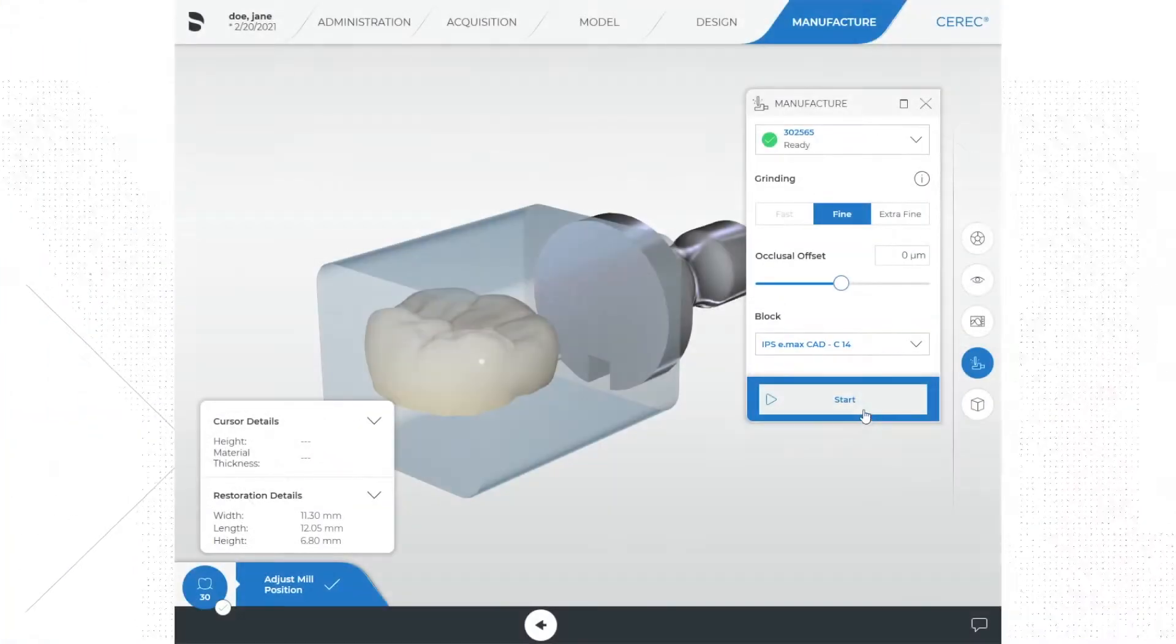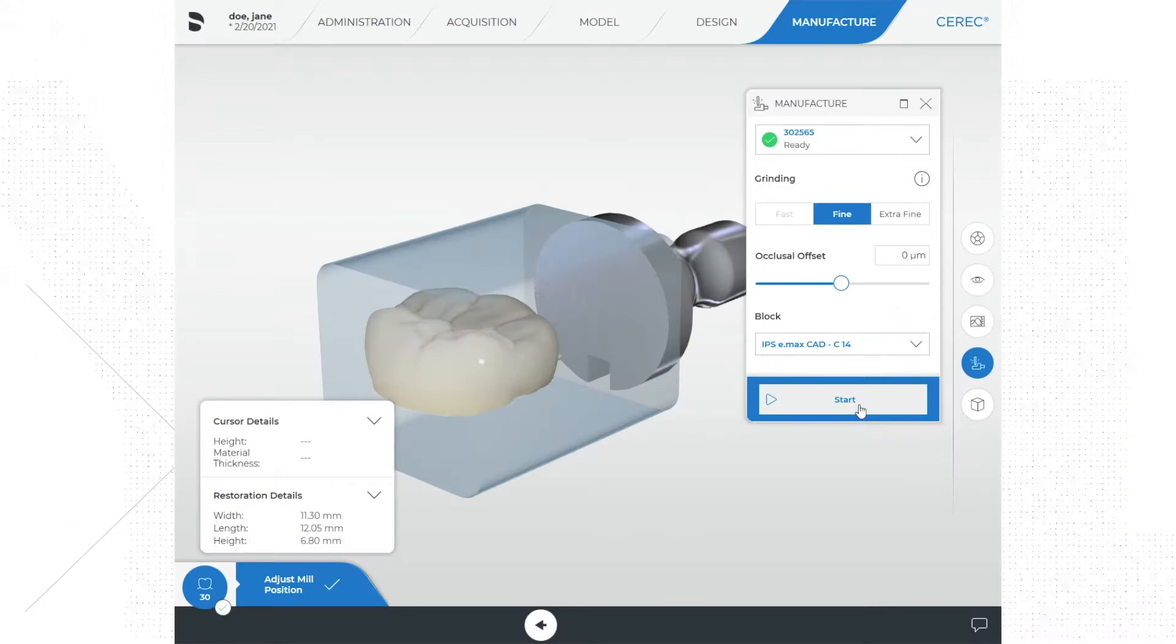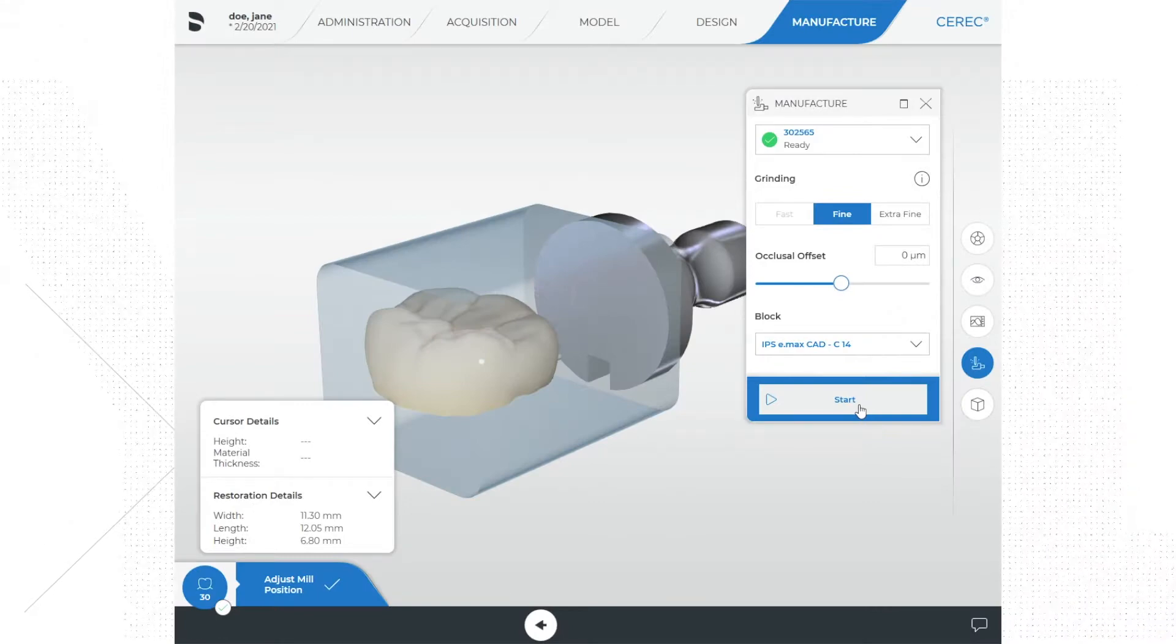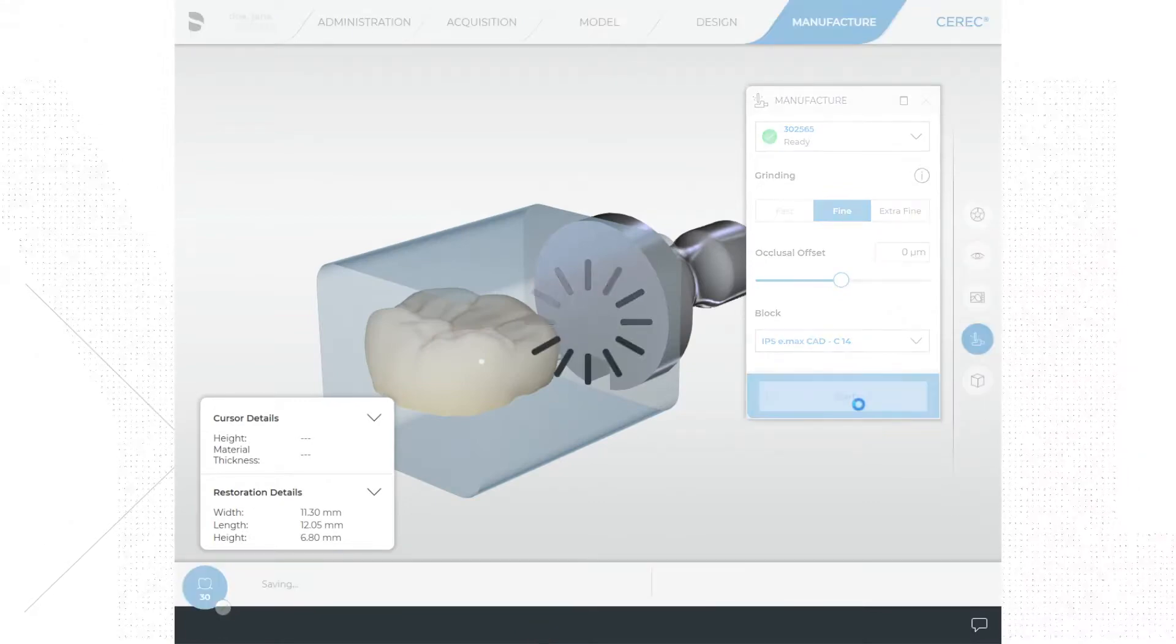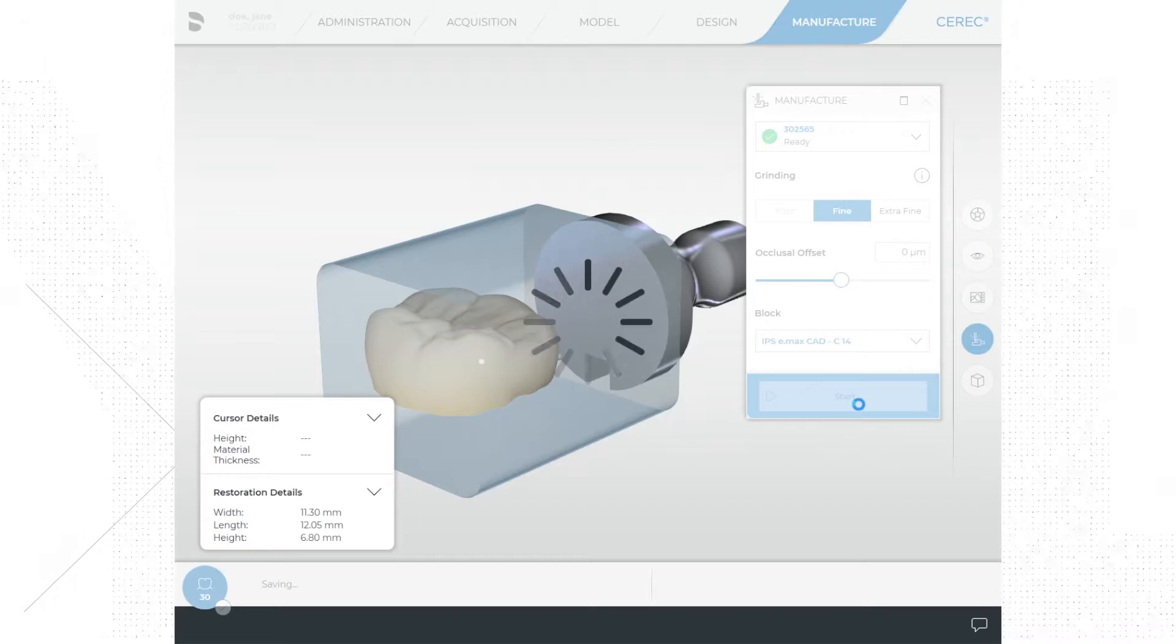At this point let's start milling. At the bottom of the screen you will see a button that says start manufacture. Go ahead and click that and start milling.